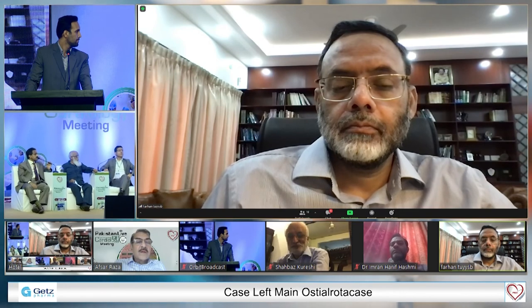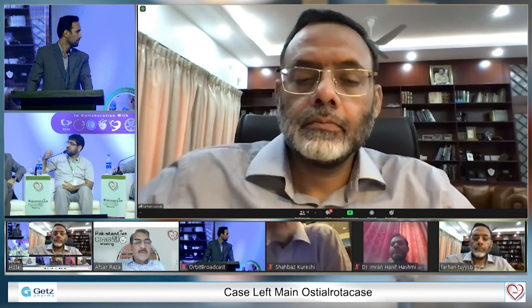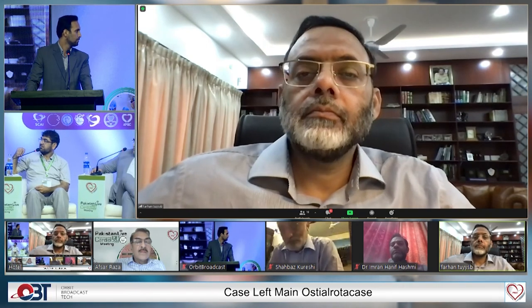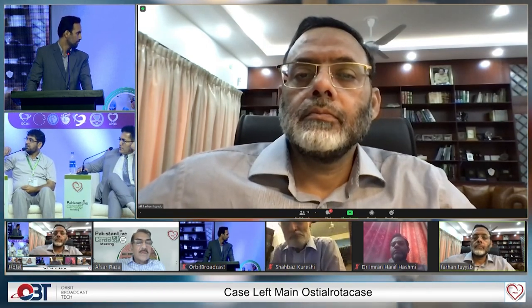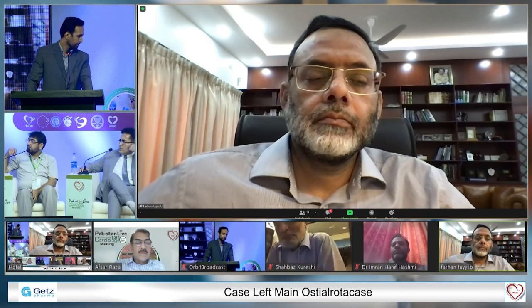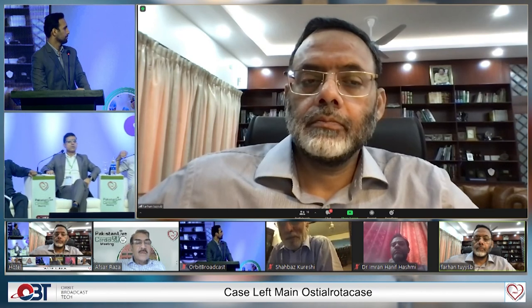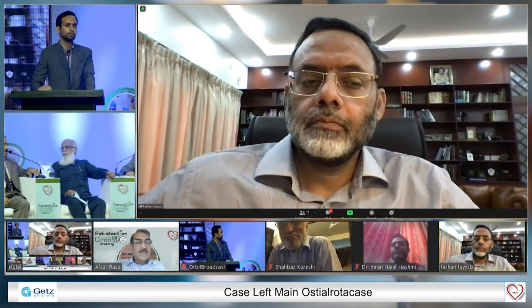Sometimes when you get distal disease, in the distal LAD or mid, that was okay. If there is a distal simple lesion, you can use it, but you don't get much support from JL definitely. EBU or XB is the one which you need to use.